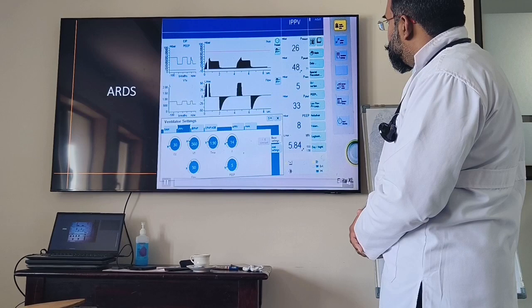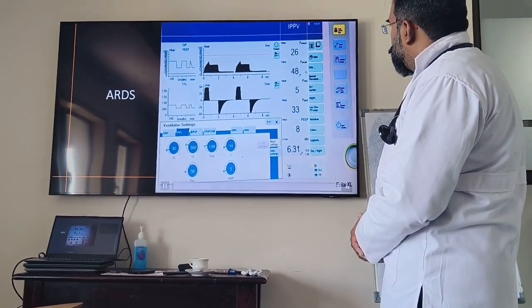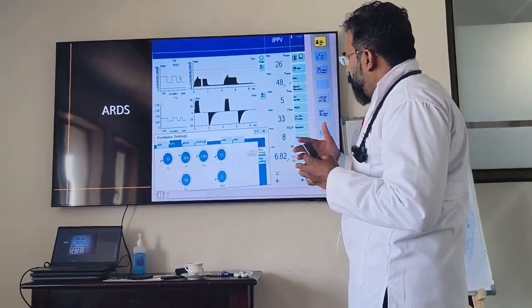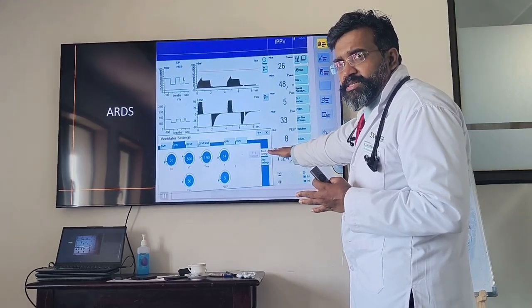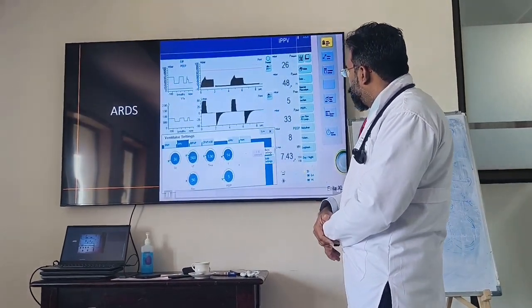Okay. My inspiratory time has remained the same, 1.9. So now I have at least gone to a high RR, an elevated RR with a satisfactory minute ventilation. Okay, 7 liters, 6 liters, I'm at the minute ventilation that this patient required. Okay, 7.34, 7.39 has come.